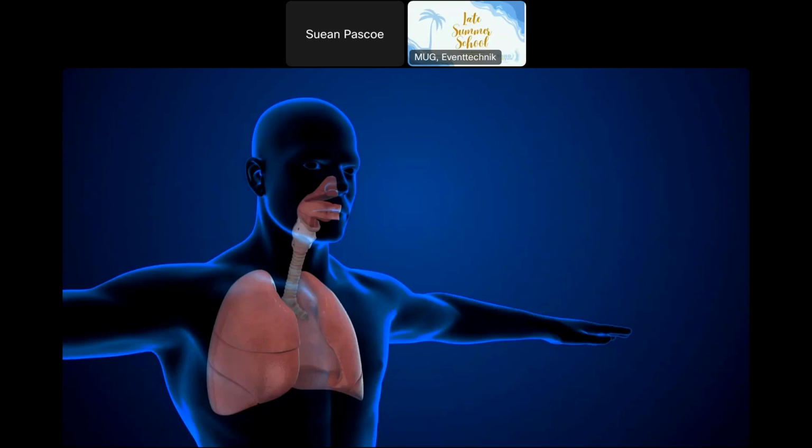And two, because when we're breathing, as much as the lungs fill in all directions, the most movement happens in the up and down plane. So the diaphragm moves down and there's more movement longitudinally than there is in other directions. And so it makes it easier to appreciate that lung sliding.